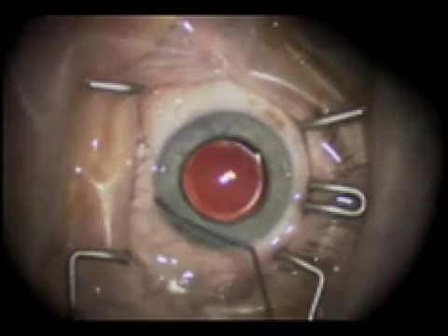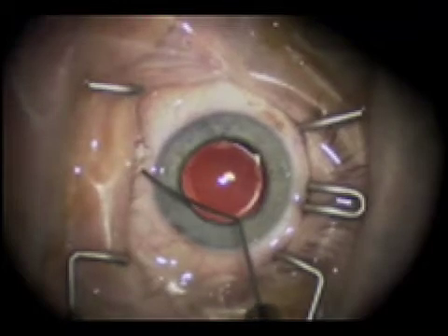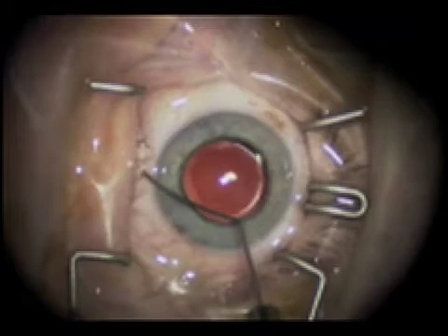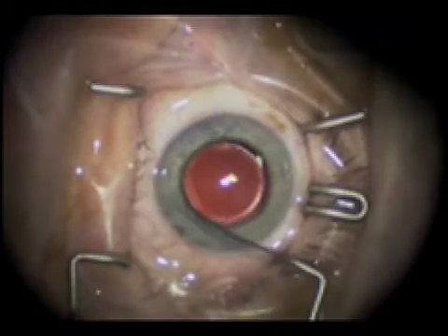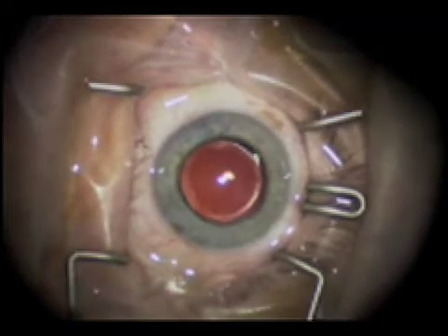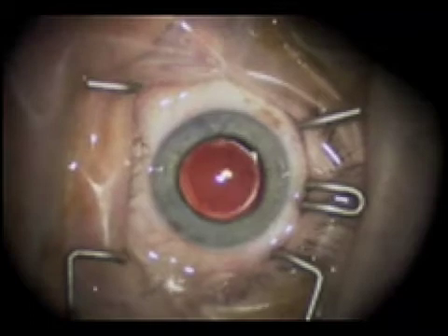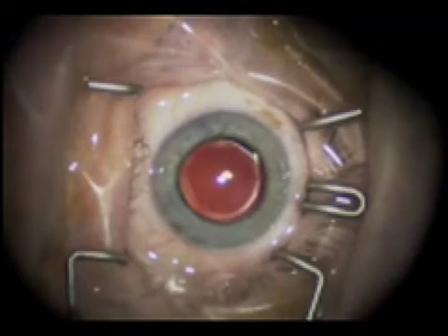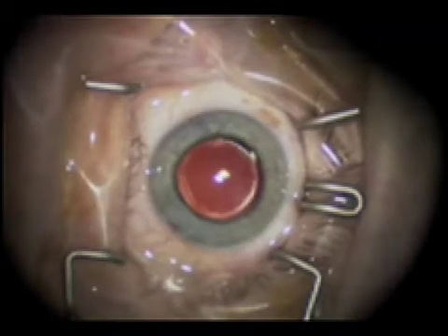By the end of this case, the lower lid has rotated out from under the drape and the lashes are now exposed to the surgical field. The presence of lashes in the field increases the risk of infection. However, the triple post design prevents this rotation, as seen in the upper lid. The central post supports the lid and helps maintain contact with the drape, reducing the risk of lid rotation and exposure of lashes.